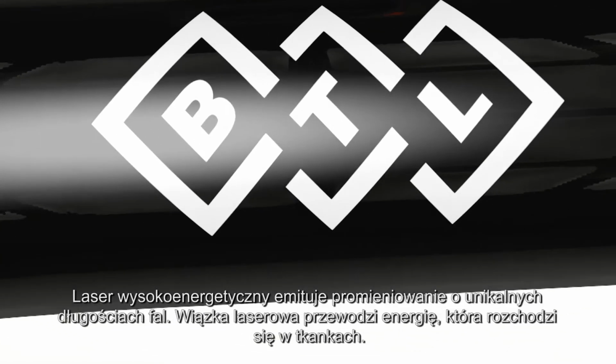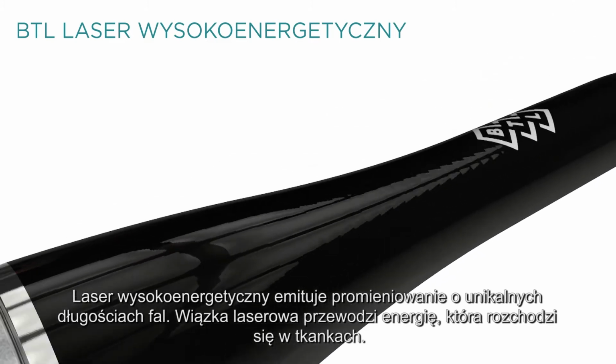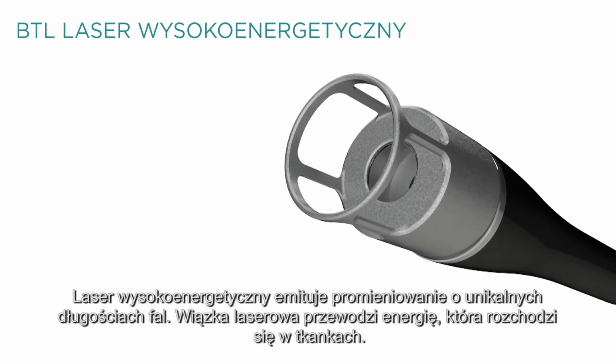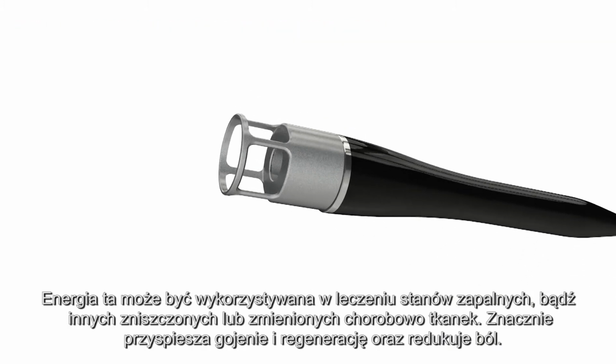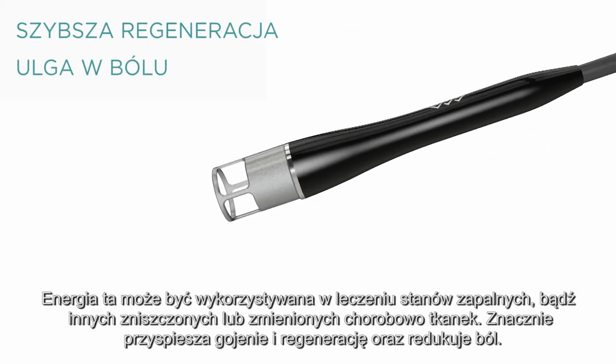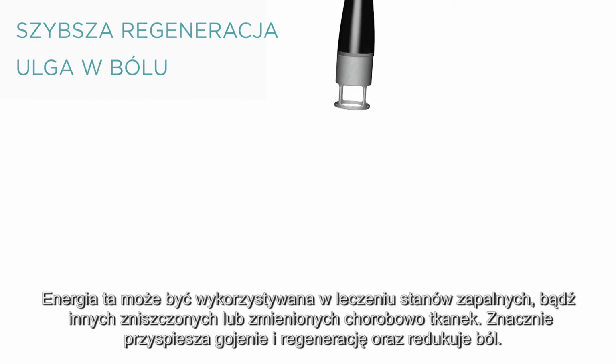High-intensity laser is a device which produces coherent light of one or more specific wavelengths. A laser beam carries energy which spreads through the tissue and can be used to treat inflamed, torn, or otherwise damaged or infected tissue, in which it speeds up healing, recovery, and reduces pain.